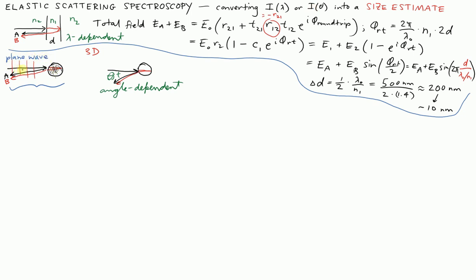Okay, now this paradigm up here where we send a plane wave in to scatter off of some target sphere, that's a well-defined physics problem, and it has a name because someone named Gustav Mie wrote down the original solutions for it in the early 1900s. So we talk about things like Mie theory. It's not the only theory, but it's the one I'll focus on here. When we have a scatterer, a sphere, being irradiated by a plane wave, theory allows us to calculate the scattering that we will measure as a function of a given angle of scatter and a given wavelength of illumination. We can now map those things out.